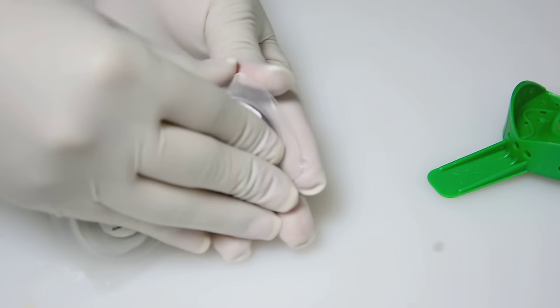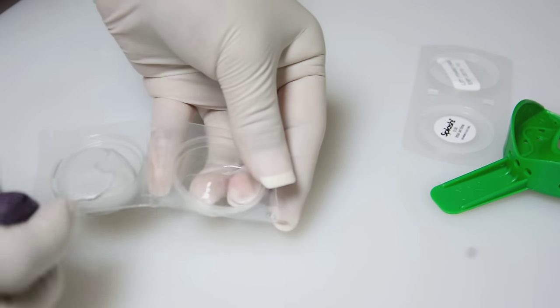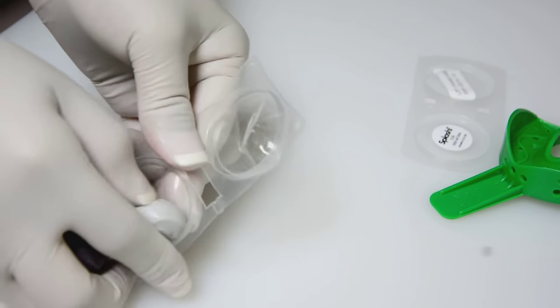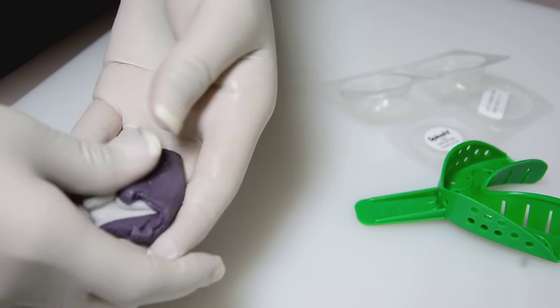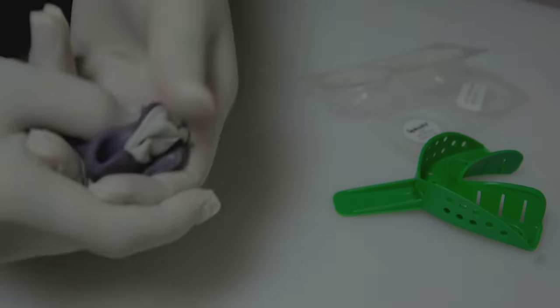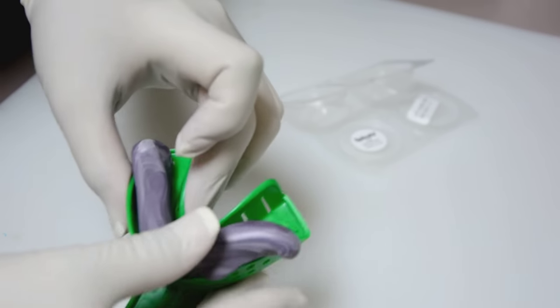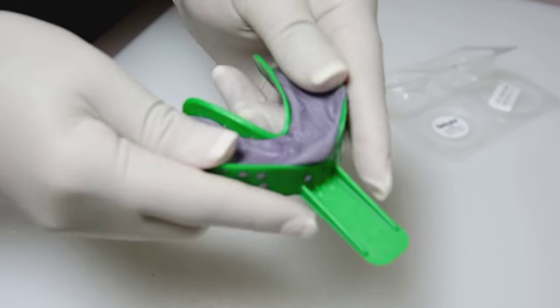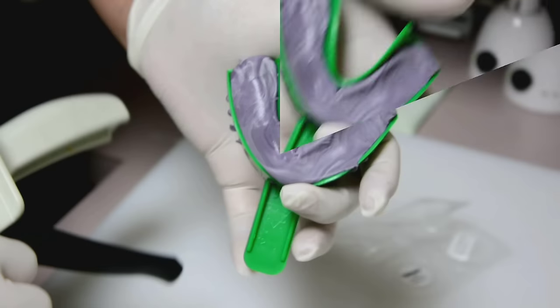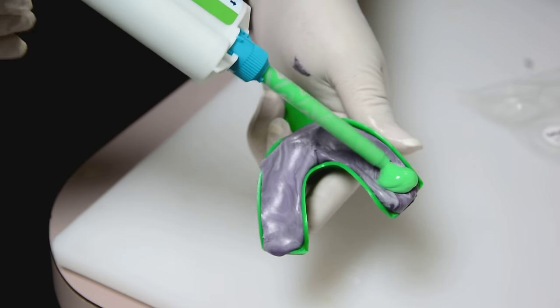My assistant is going to mix up the putty — she's going to take one scoop of each and mix them together. It takes about two minutes of working time. She'll go ahead and load it into the tray and trough it, making a trough right in the center where the light body is going to go. Then she places the light body in.